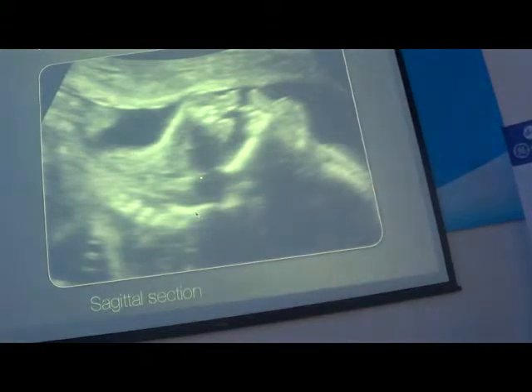So what you have to do, you have to put the head of the baby in this position. The head is on the back. And if with the 2D, you can see the palate like this, you can do a 3D volume and you can work with this volume.